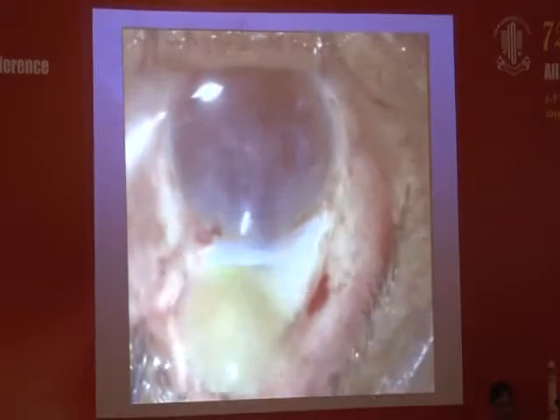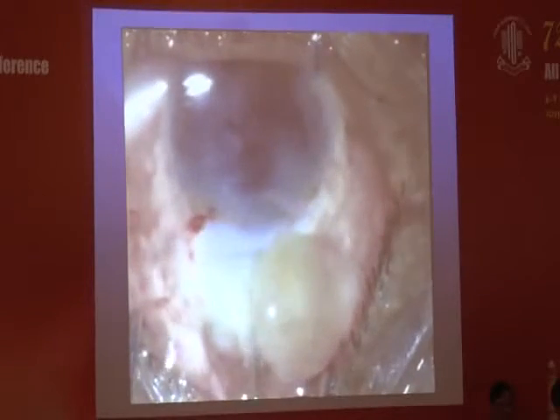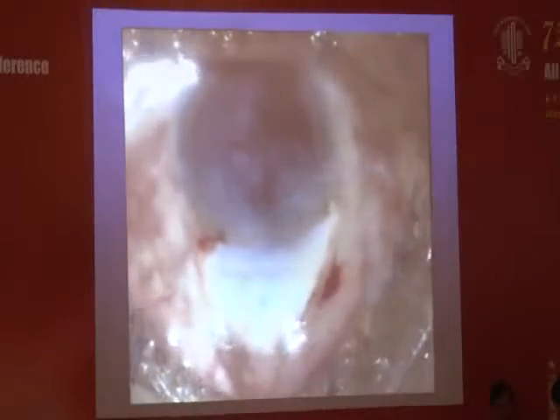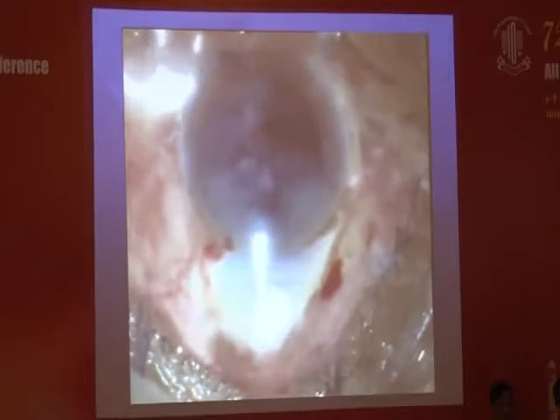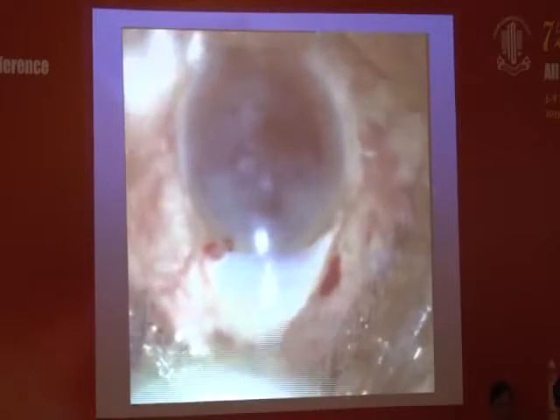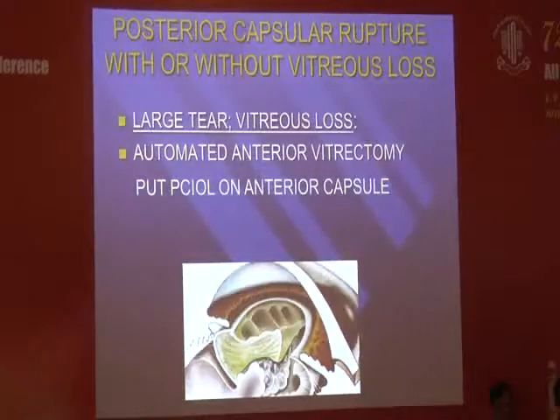Here, once it has come out, I had not noticed this, but here you can see that in the superior there is a PC tear. So that also you will have to see. And now another is a posterior capsular rupture that we have seen.